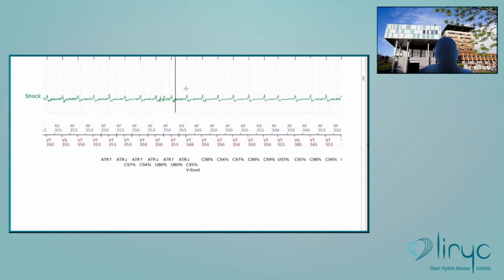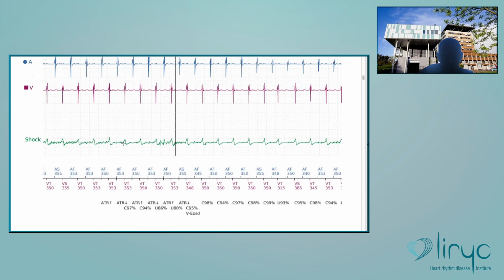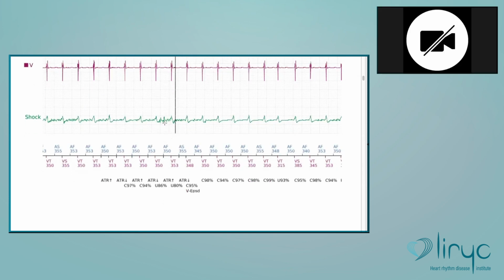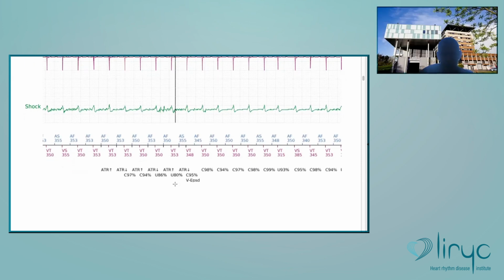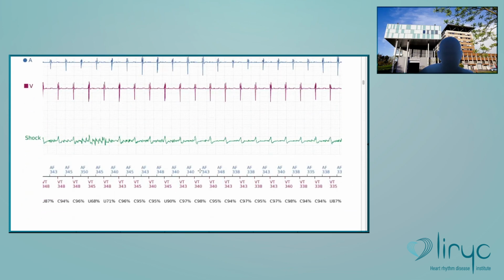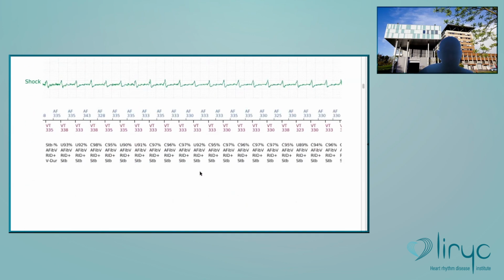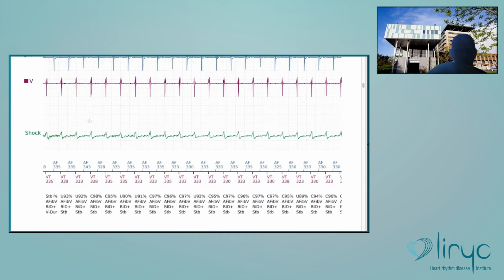So it's one-on-one tachycardia, and the percentage here is not very high. You see the poor quality of the signal here? You see the percentage here? You see this poor quality at the end, low number. But okay, it's correct. And then it still remains above the threshold, and you arrive at the diagnosis. So the diagnosis of V faster than A is wrong, since you are one-on-one, okay?